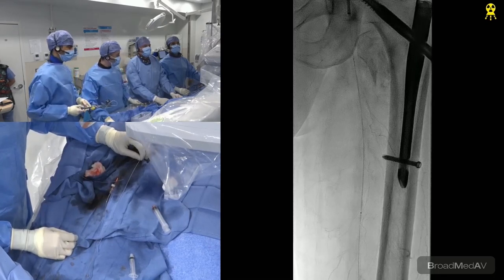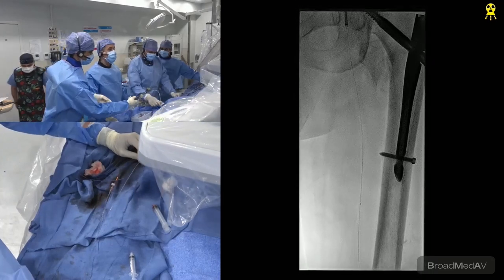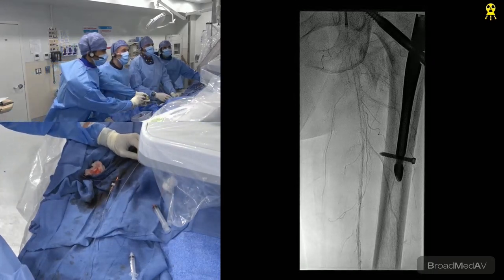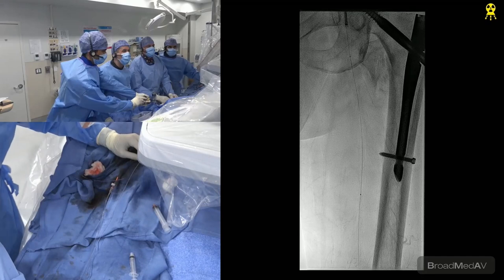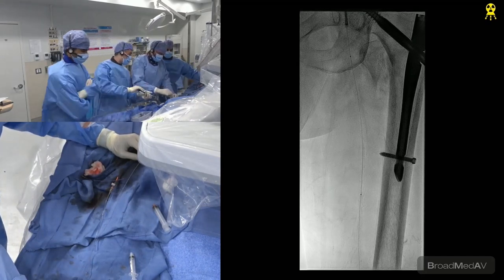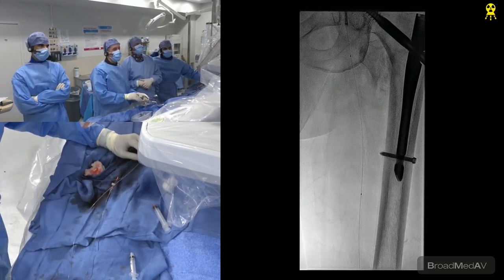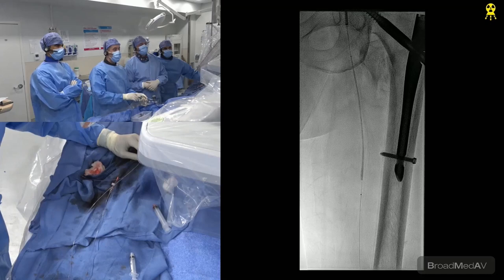Now let's look at the ostium a little bit. A little dye in the ostium. And make sure we get the proximal. I'm actually okay with a little bit of that angle. Roman, I'm actually watching LA. Let me give you a small test. Roman, you're on floor. Come back just a touch. That's good. Okay, 1 second. Perfect. Come back. Going forward.